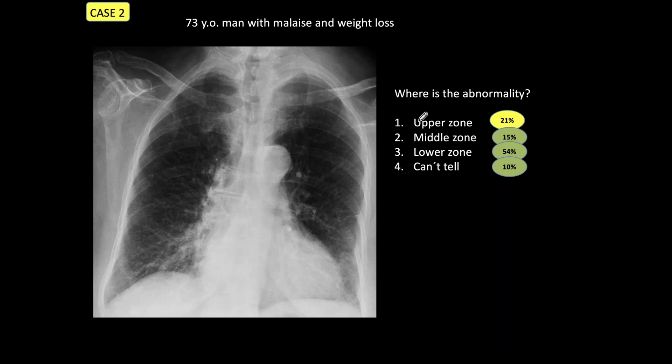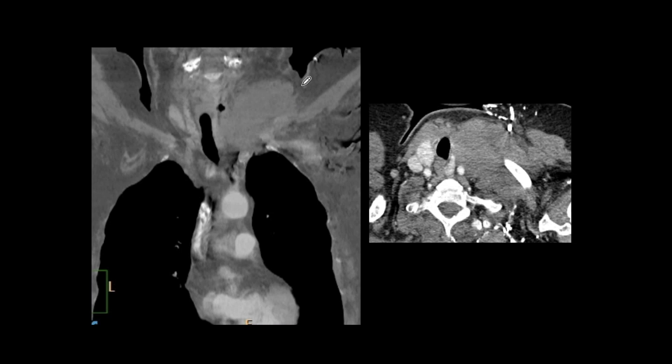About 21% of participants gave the correct answer. The abnormality is a protrusion of the right wall of the trachea — there is a curve there indicating a mass pushing into the trachea. About 90% of the time this mass will be a thyroid mass. But in this particular patient, coronal and axial CT shows a large mass not related to the thyroid, which on biopsy proved to be a lymphoma.